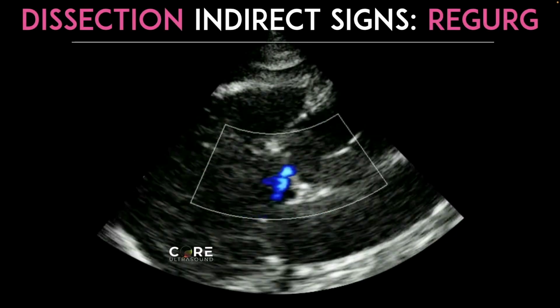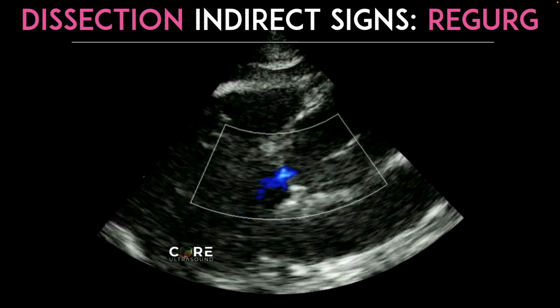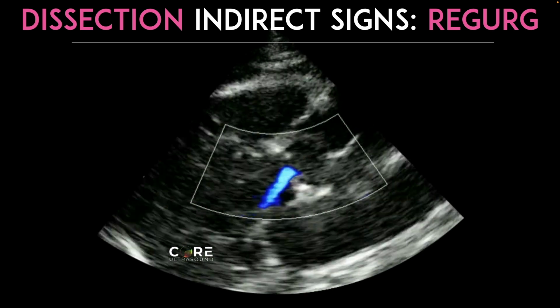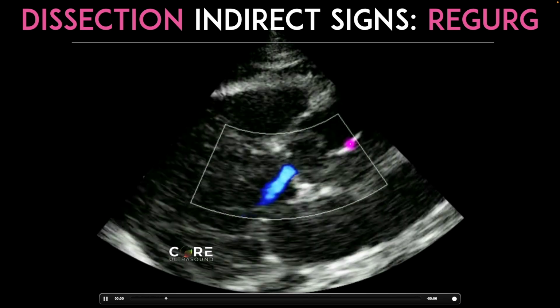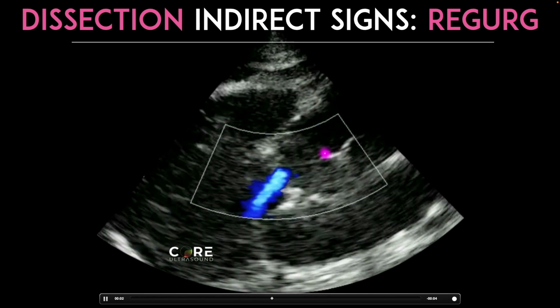That's actually a pretty sick patient. You see the ejection fraction is already pretty low. They're already pretty malperfused. See this as well. I'm a little more concerned. And then right here is the dissection flap.